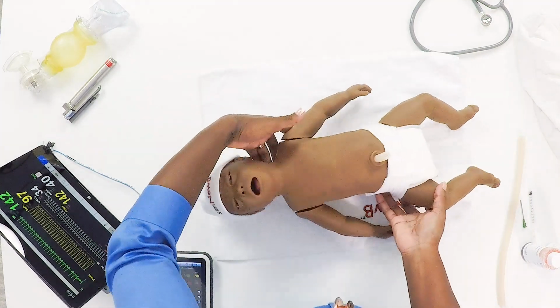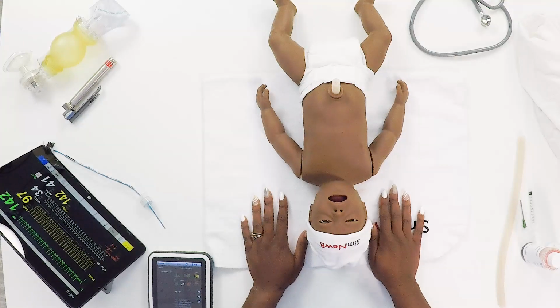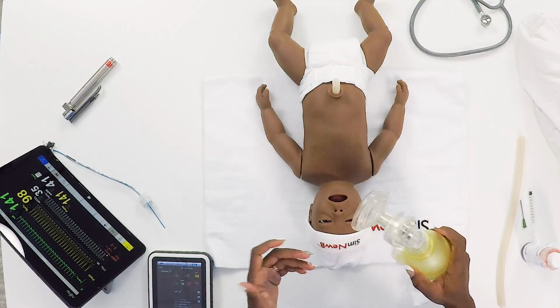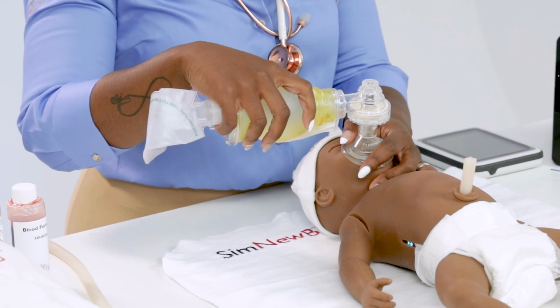All right. So first things first, we're going to practice that PPV, or that positive pressure ventilation. I'm going to grab my BVM. Always make sure that your BVM is the correct size for your patient. And you're going to go ahead and place a great seal on there.